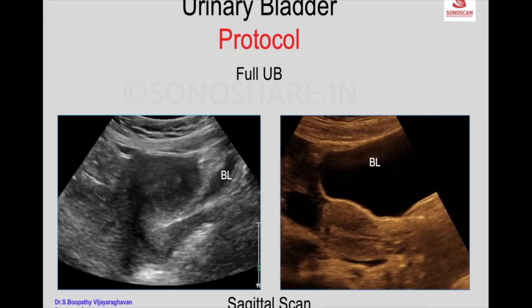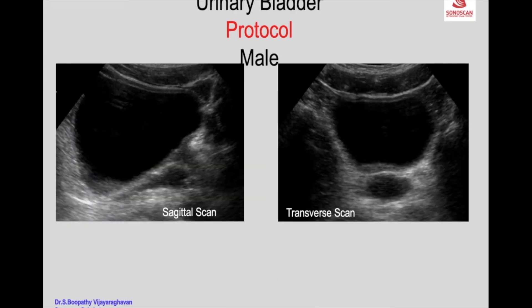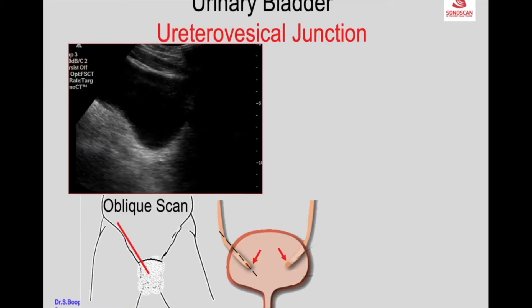A full bladder is required. Now you see the empty bladder — you cannot study the empty bladder. The bladder has to be full to study the bladder as well as structures posterior to it. In the male, you see the sagittal scan and the transverse scan showing the bladder as a fluid-filled structure, the distal ureter, and the distal uretero-vesical junction.